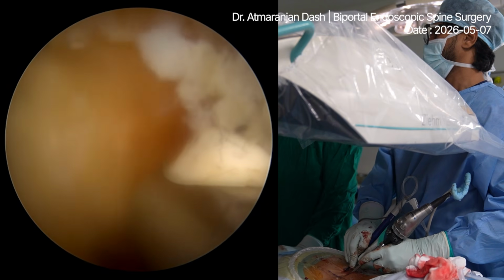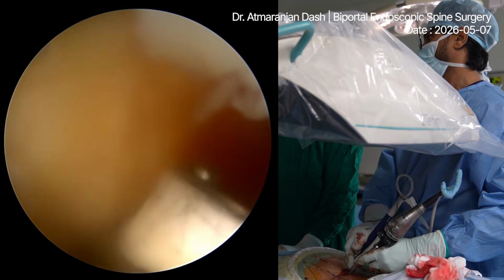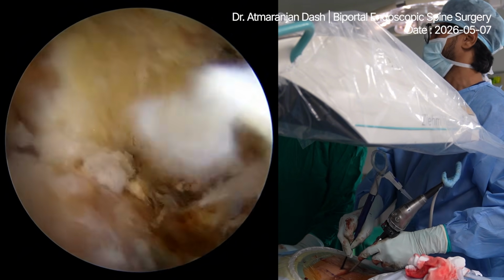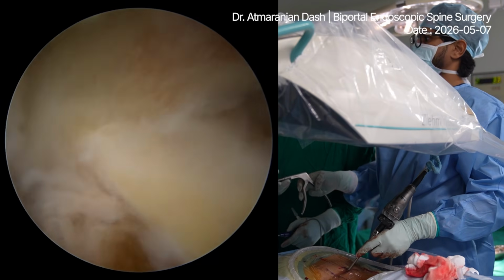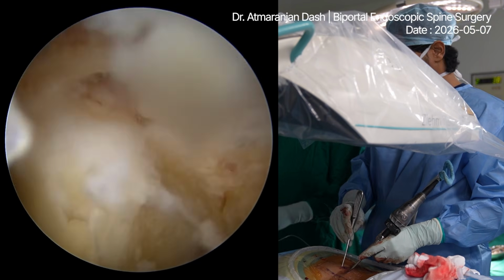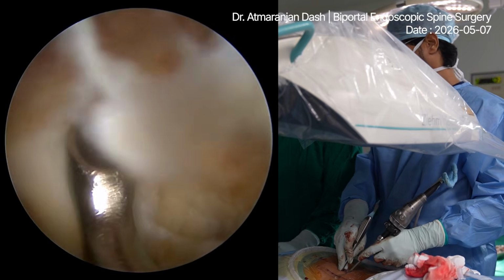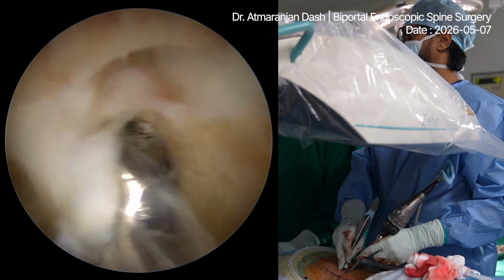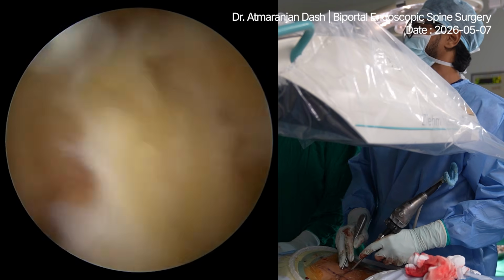Ablator. So these are bony oozing, coagulation. A little more of the drilling, curette. So you see I am entering the foramen. This is the area where you have the SAP IAP junction. I was drilling the SAP, but you see this is the joint. This is the foraminal ligament.